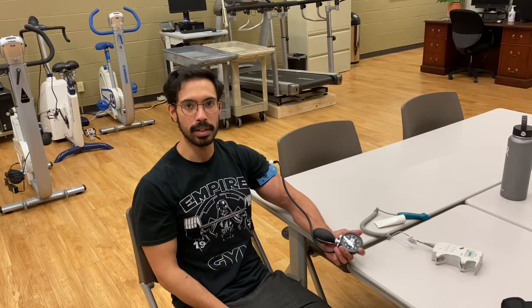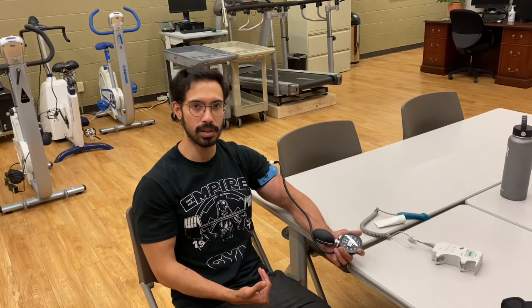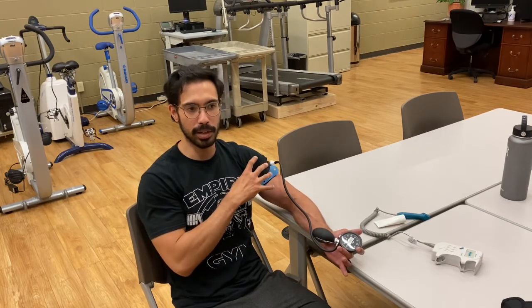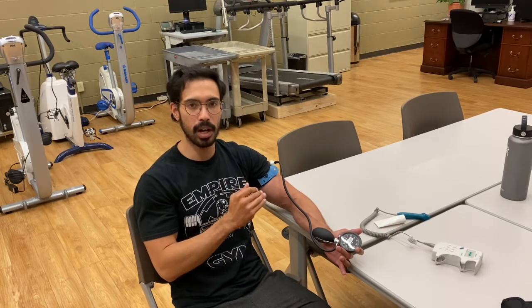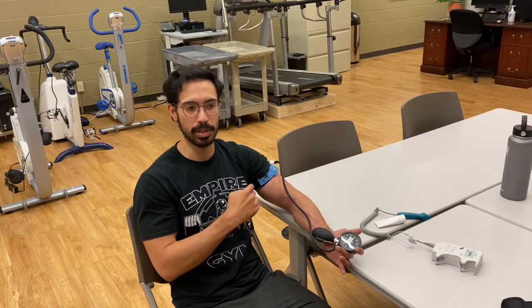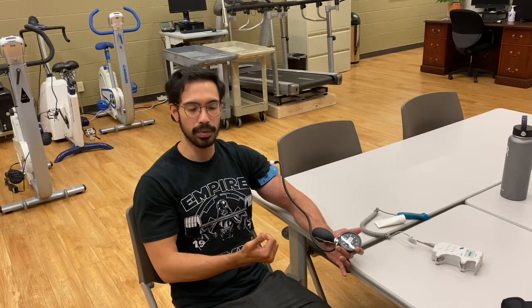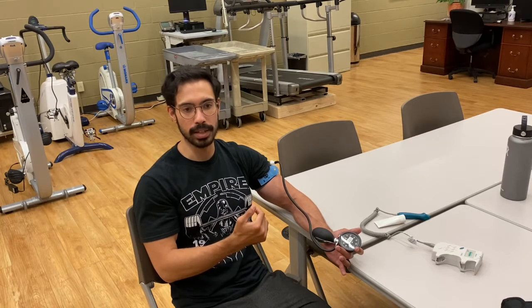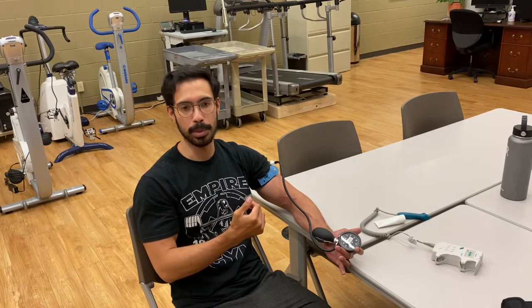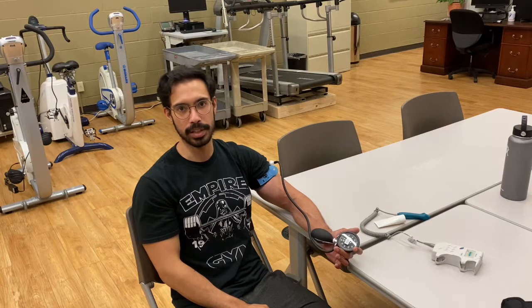So BFR entails full venous occlusion, which means that we're completely restricting blood back towards the heart on the target extremity, whether that be the upper body, the arms, or the lower body, the legs, as well as partial arterial occlusion. So we're cutting off a significant amount of blood flow from the arteries, going from the heart out to the extremity, but not completely, because if we completely cut it off, we're increasing the risk of things like ischemia or damage to the vascular walls in individuals that are predisposed to those types of incidences, so people that have hypertension, peripheral artery disease, etc.